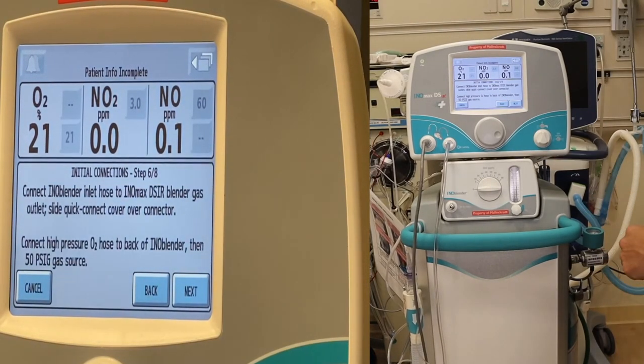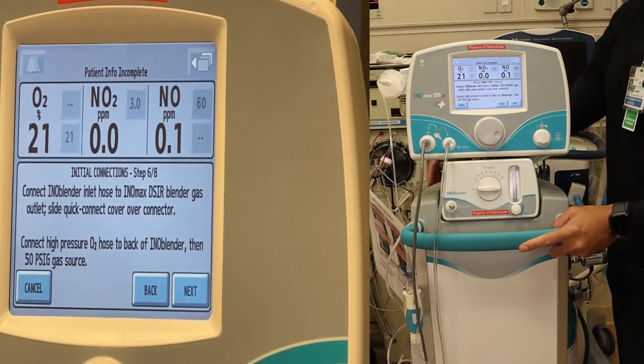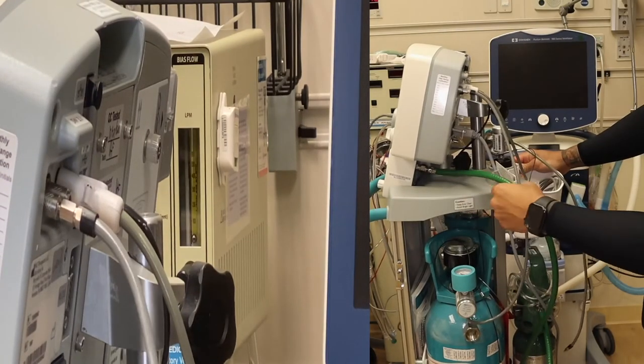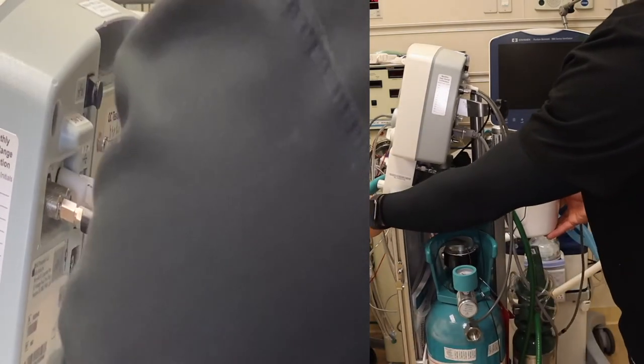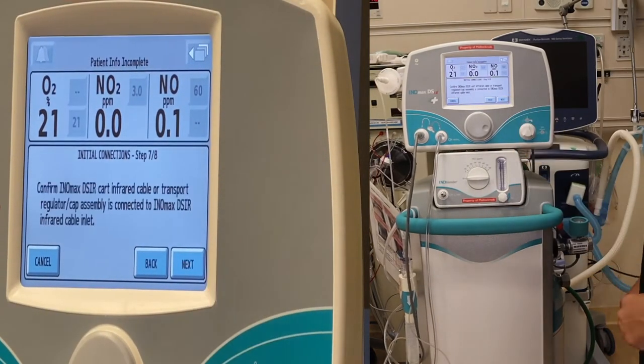Connect the INO blender inlet hose to the INO MAX DSIR blender gas outlet. Slide the quick connect cover over the connector. Connect the high pressure O2 hose to the back of the INO blender, then to the 50 psi gas source. You'll find your high pressure O2 hose connected to an E-cylinder — make sure your E-cylinder is in the auxiliary. Press next.